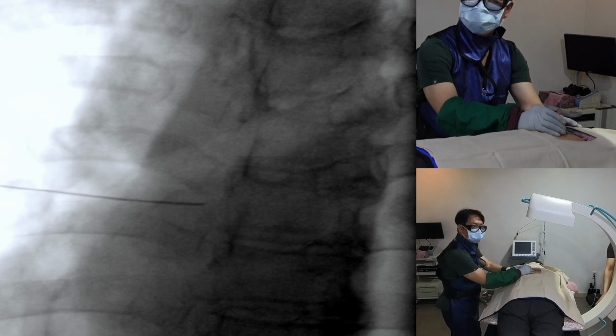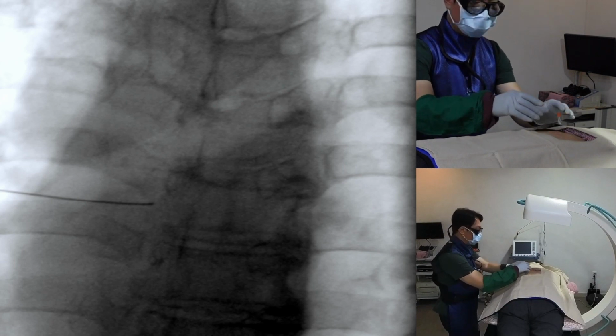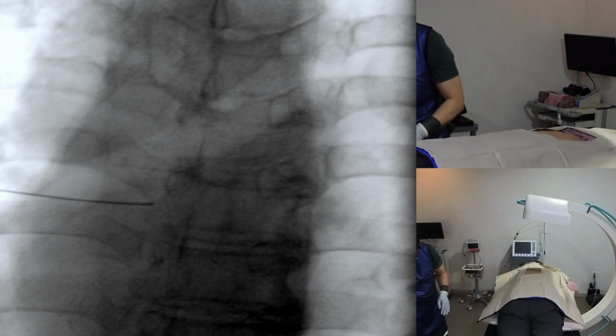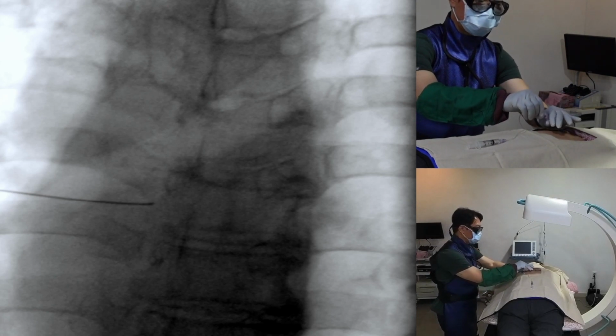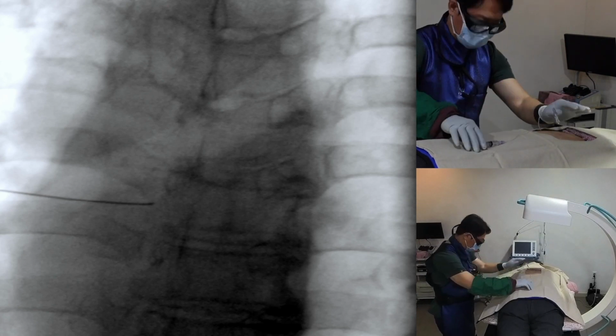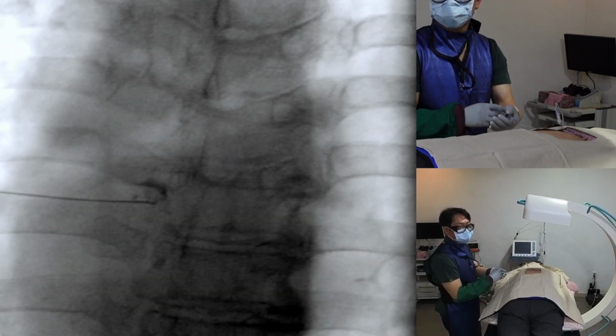I can precisely determine the needle depth required to reach the foraminal space using the AP and then the contralateral oblique images. For the left transforaminal injection route, I aim for the 6 o'clock position under the pedicle as my final needle destination in a contralateral oblique image.